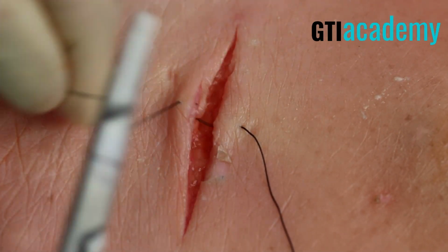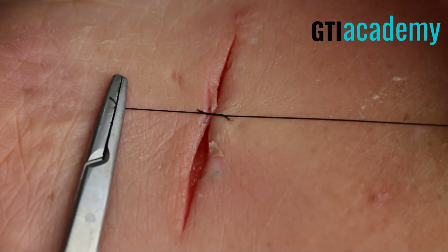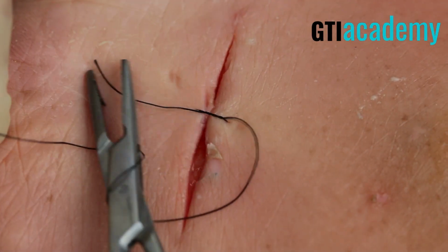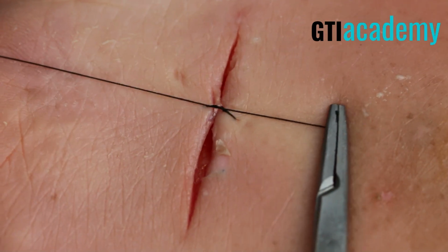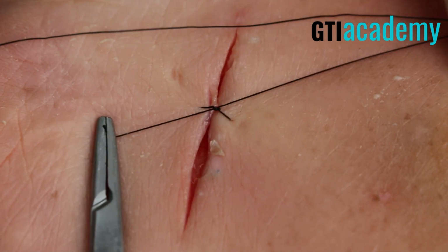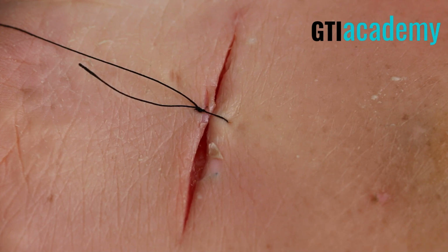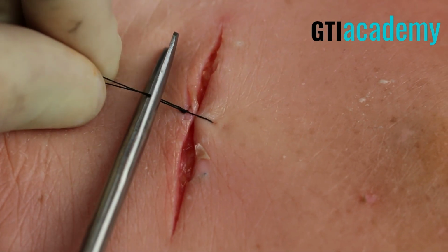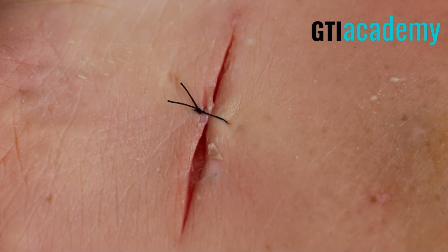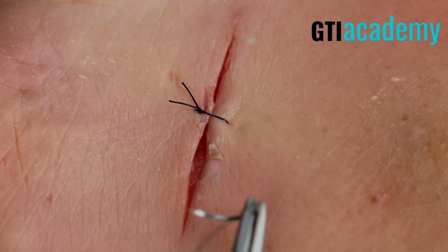Now I'm going to lay a surgeon's knot. Simply wrap the suture twice around the needle driver and complete. See how flat this is? And then one, and a second where you just wrap the suture once around the needle driver, and I'm going to pull this suture knot to the left. It's really just a preference, but it allows the person taking the sutures out to take them out more easily.